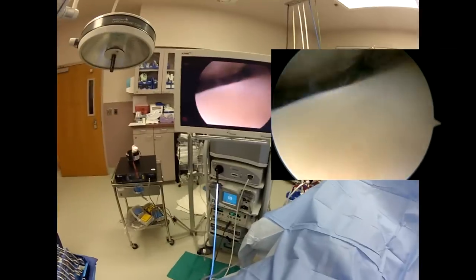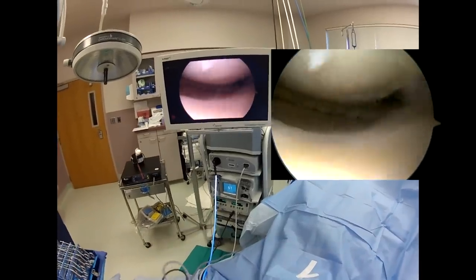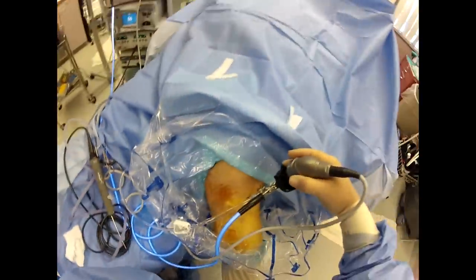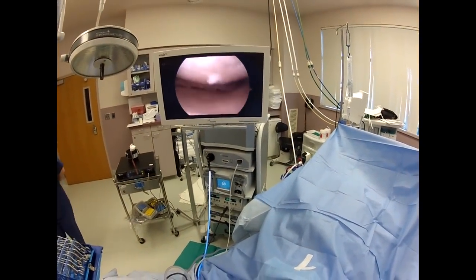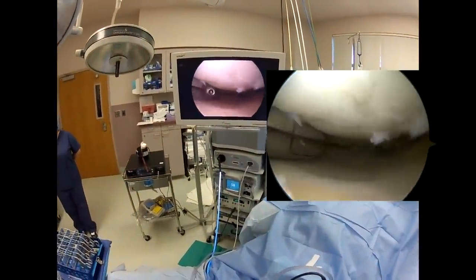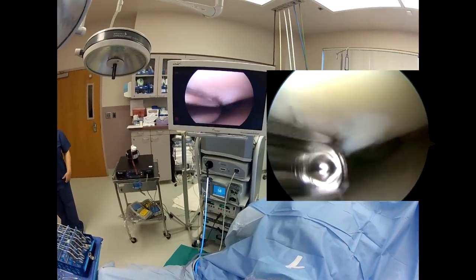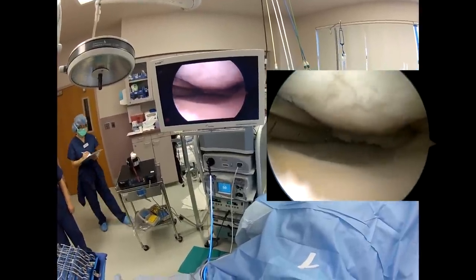The other thing we need to do is use the pedal — you want the middle pedal, because I can't do everything when it comes to this. Hit the middle pedal again. So we're going to work on a little chondroplasty here, smooth out the cartilage. You can see where I took the upbiters.